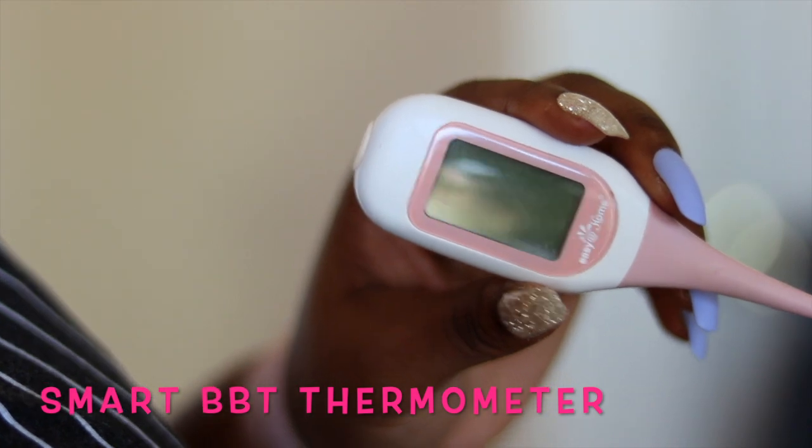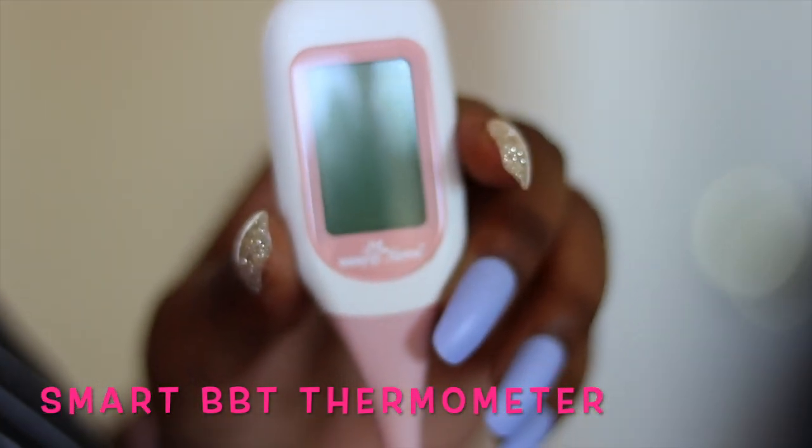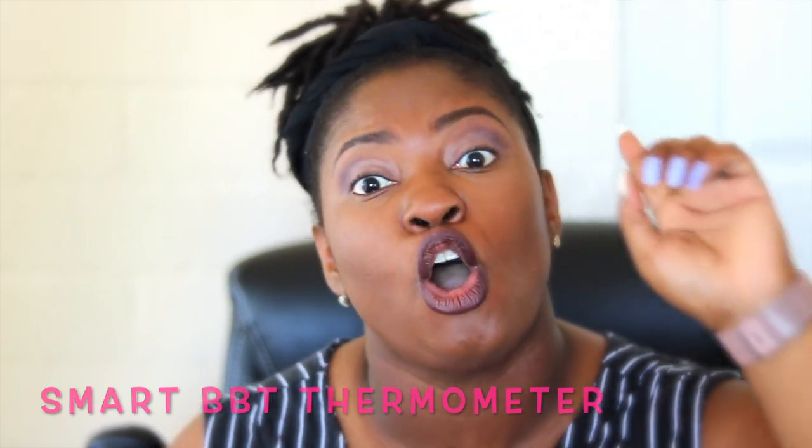The next thing I have is my Easy at Home thermometer — this is a Bluetooth thermometer that connects directly to the app. In the morning, before I get out of bed, I open the app first and then take my temperature. I made the mistake of not doing that once and it didn't record correctly. I've had this for about a year and never had to replace the battery.